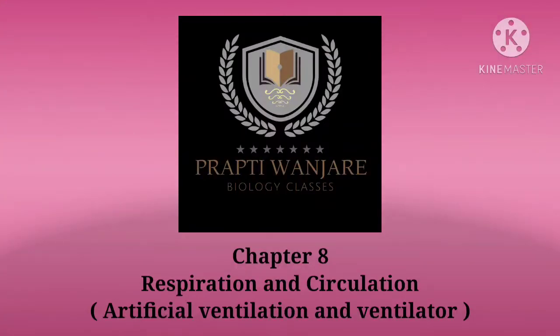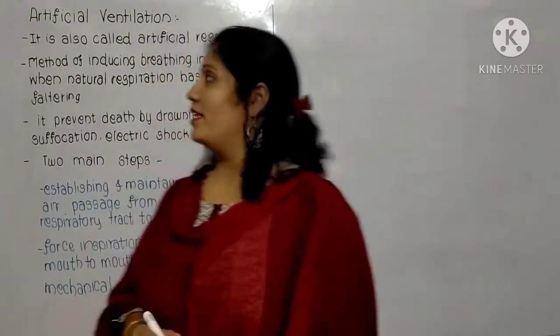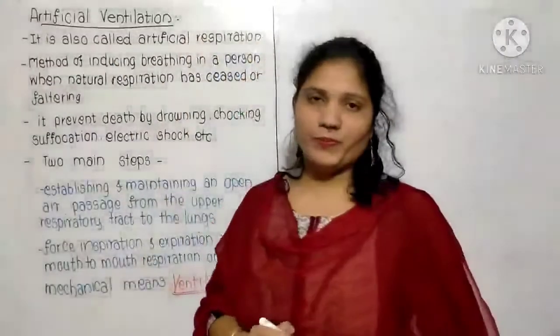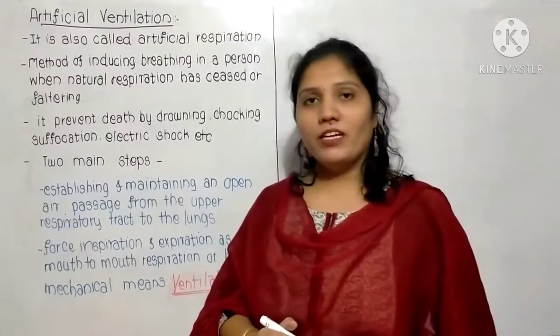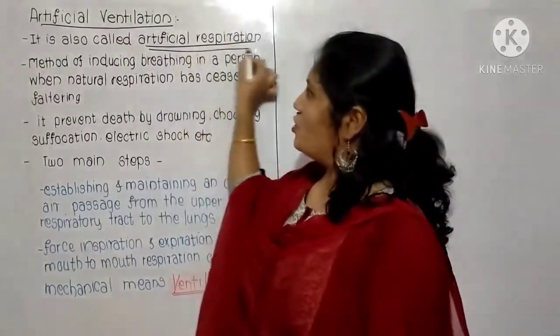Today we are going to study artificial ventilation and ventilators. Now the next topic is known as artificial ventilation. It is also known as artificial respiration.